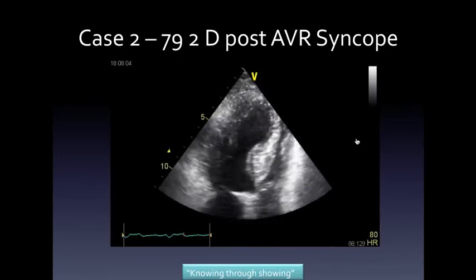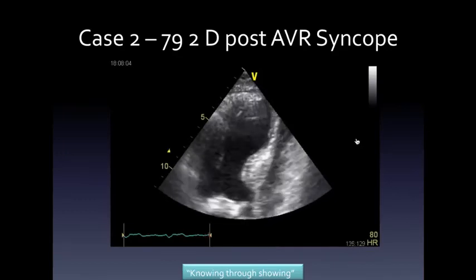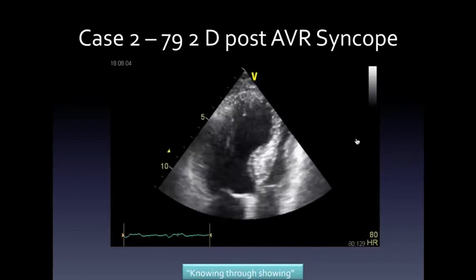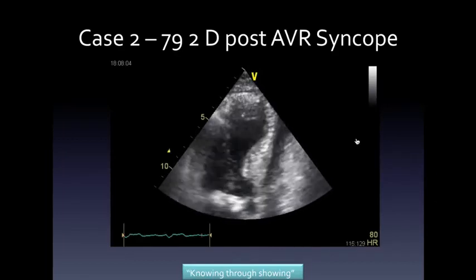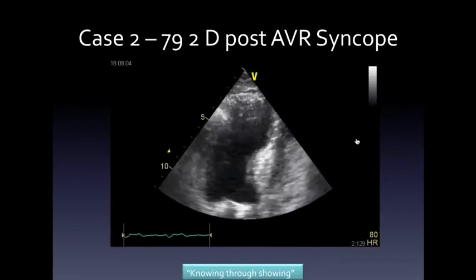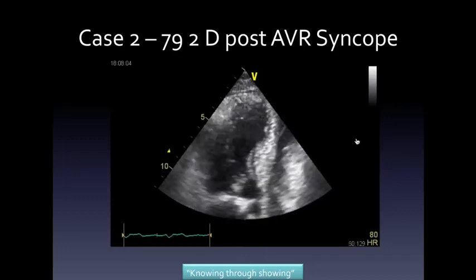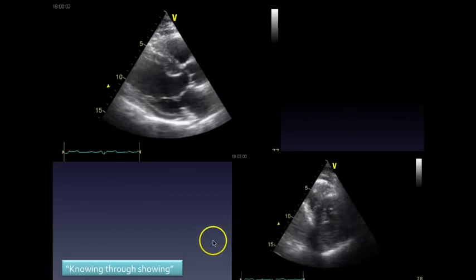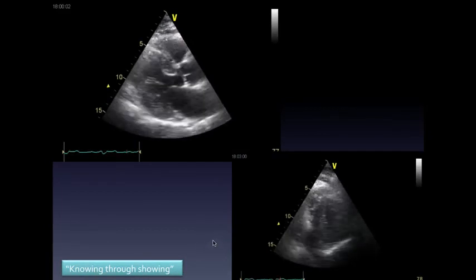And I would caution you against saying with definitiveness that his ventricle is good, bad, or indifferent. I just throw that up to say, that's just the one shot. Just be careful on the one shot. And you correctly didn't fall for it and make a comment on his ejection fraction. Let's take another view. In fact, let's take two views. So this is the parasternal long axis view. And this is the parasternal short axis view.